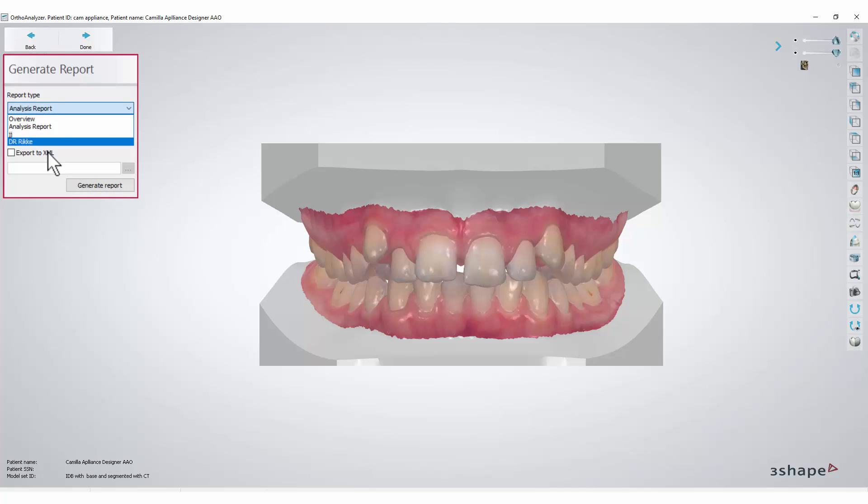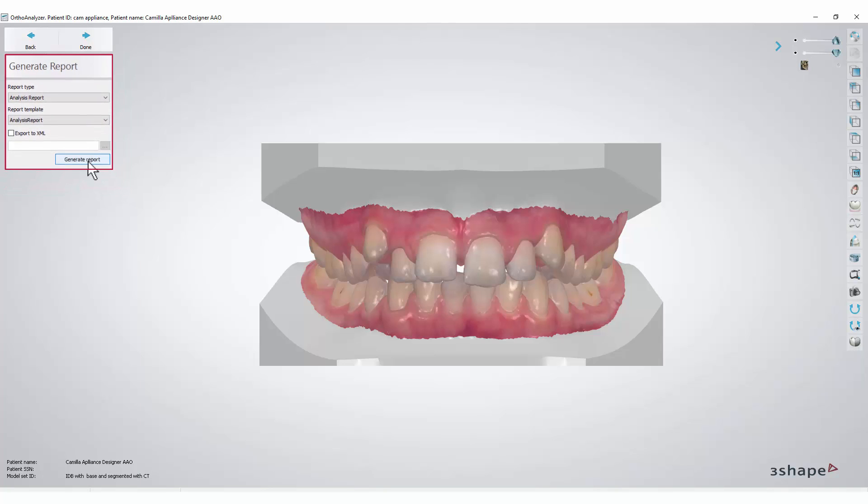For the purpose of our video, we're going to choose the Analysis Report then click the Generate Report button.